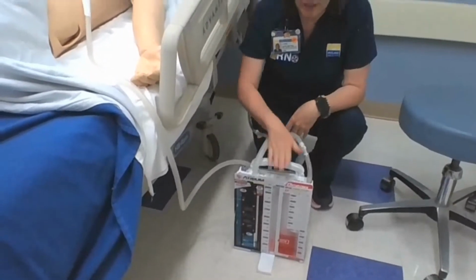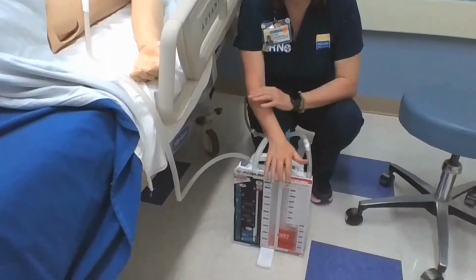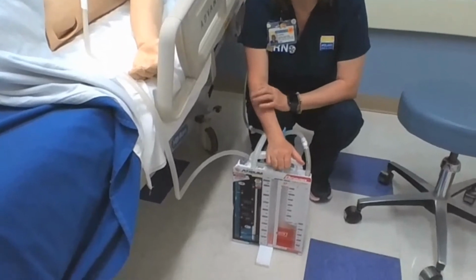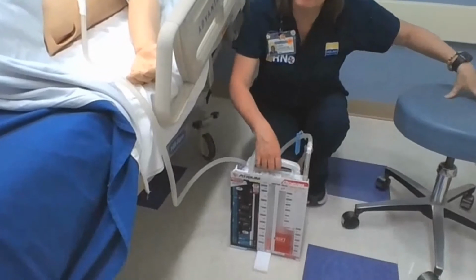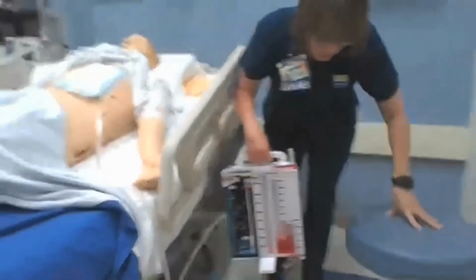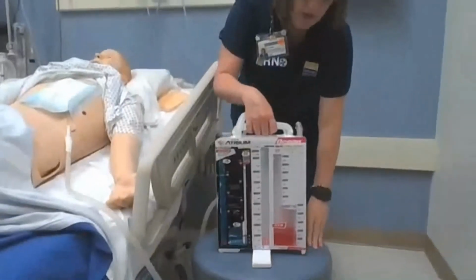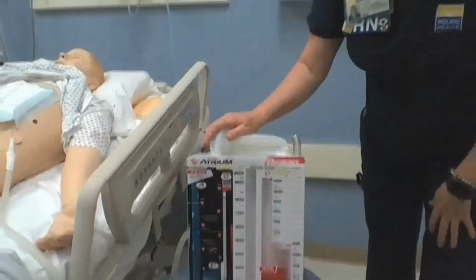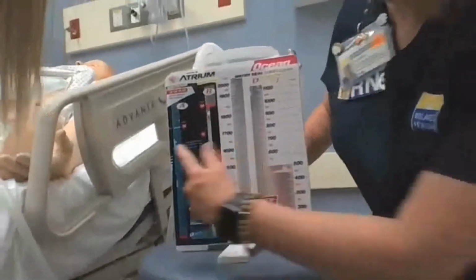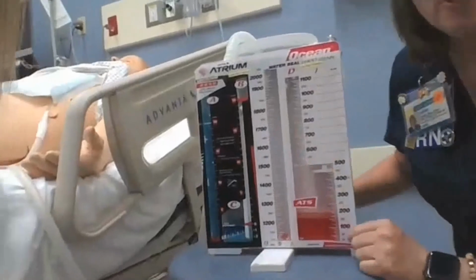The next thing we're going to look at is the drainage system. The drainage system should never be lifted above the level of the chest, but I'm going to put it up here on the stool so that we have a better view for the video. Okay, so let's take a look at the drainage system. Now, looking at the drainage system, we have basically four chambers.